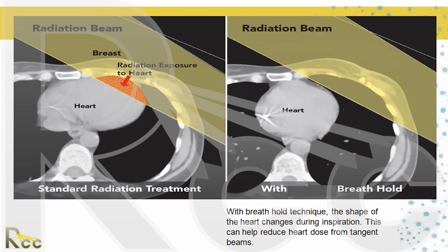What I love to talk about is the physics of radiation therapy, and how as a physicist at night, if I'm calibrating the machine, I test my beam in a tank of water. I assume the patient is a tank of water, right? But the patient's not a tank of water. The patient has biology, and you have to look at how the radiation is affecting the DNA. So even though I'm a physicist and I'm looking at dose and I'm measuring the machine is accurate, I can tell the doctor, yes, this patient's getting 70 gray. There's a whole biology behind that takes place. And that's the other half of radiation therapy. So there's the physics of it, and then there's the biology of it. And I would encourage you to study the biology of the radiation also.